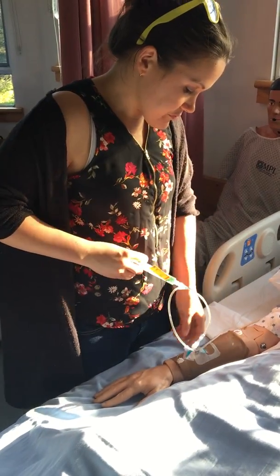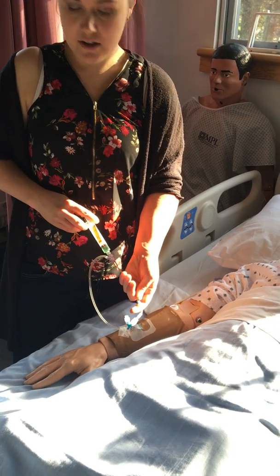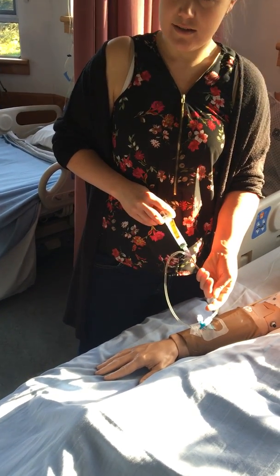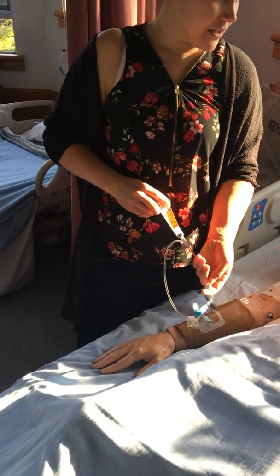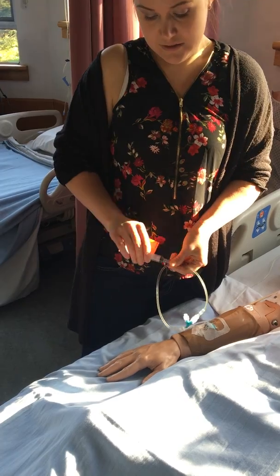And then this medication needs to go in over 30 seconds, so I'm watching the clock. And I'm slowly pushing it over 30 seconds. And I'm examining my client because Narcan often doesn't take very long to work.